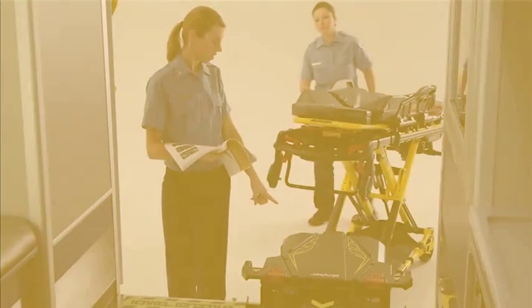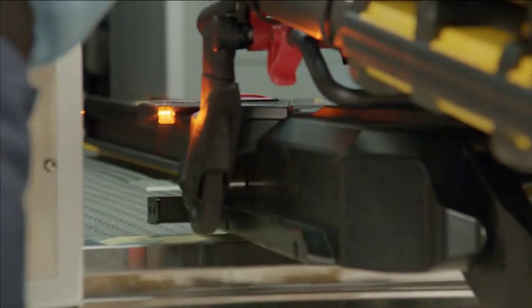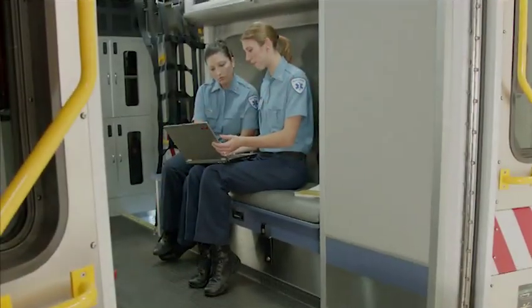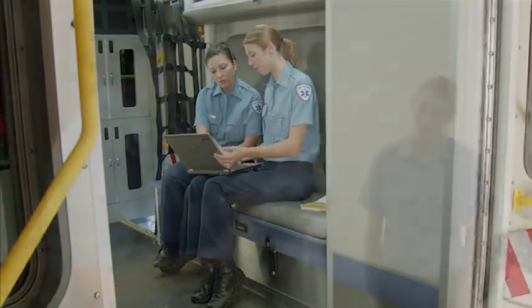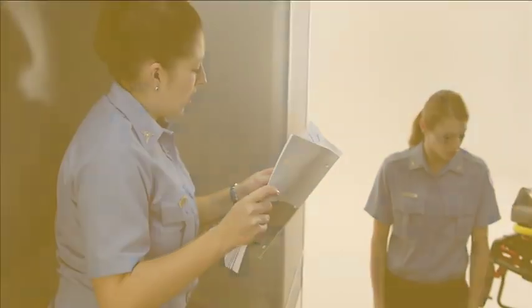Always set the load height of your compatible cots with Power Load prior to placing the vehicle into service. Reference the appropriate compatible cot in-service DVD or operations and maintenance manual for instructions on how to set the appropriate cot load height.